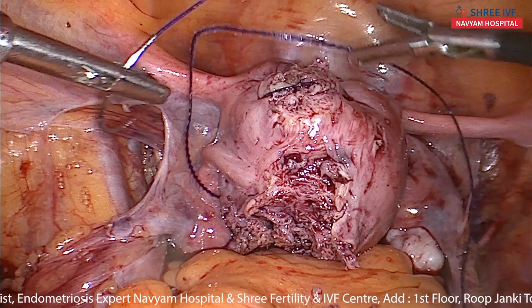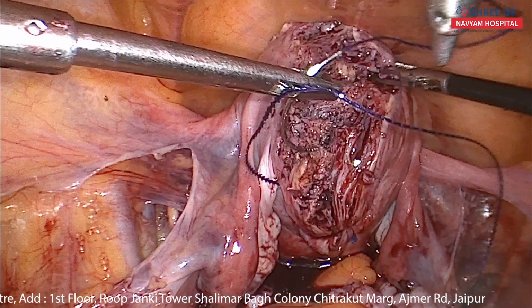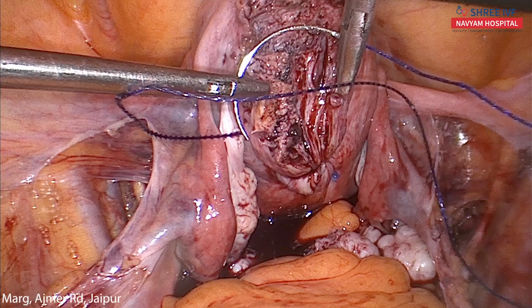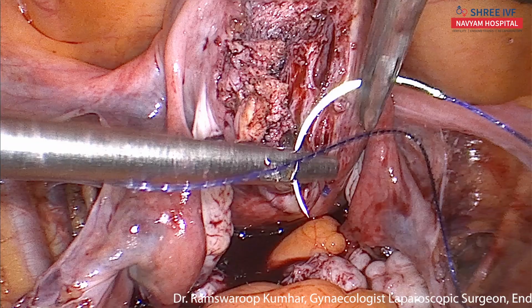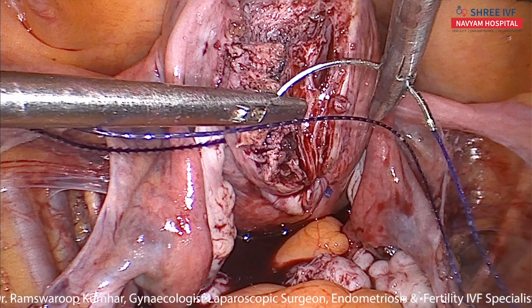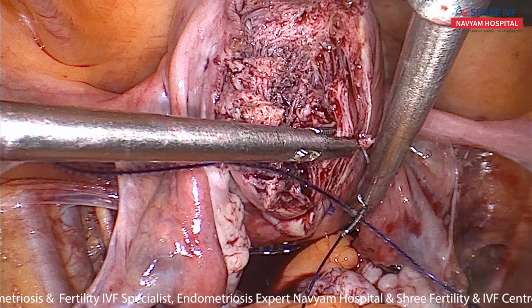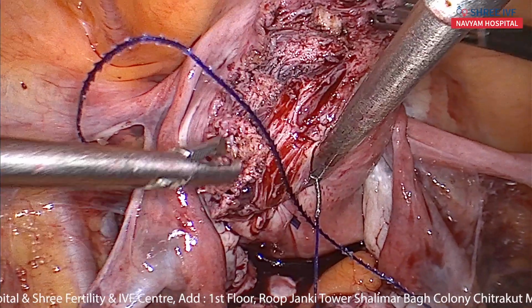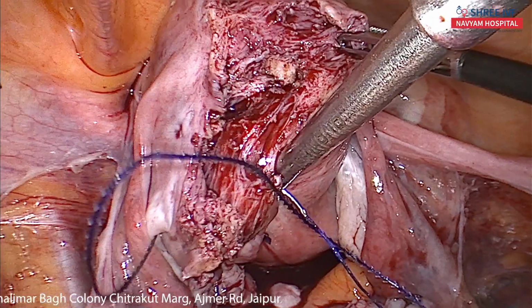Hold the uterus above, not the suture. Full thickness bite, trying to take it out on this side. Good.